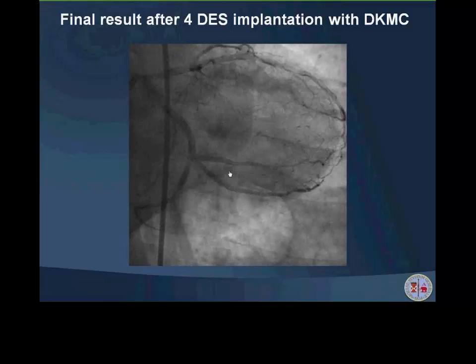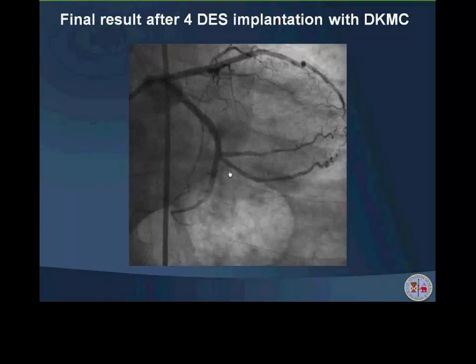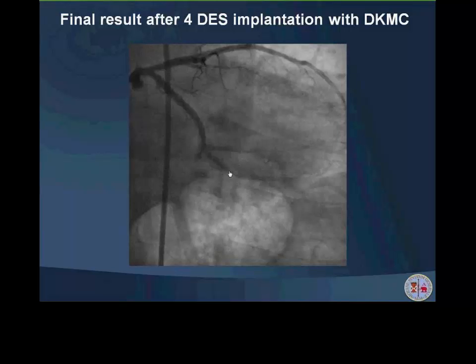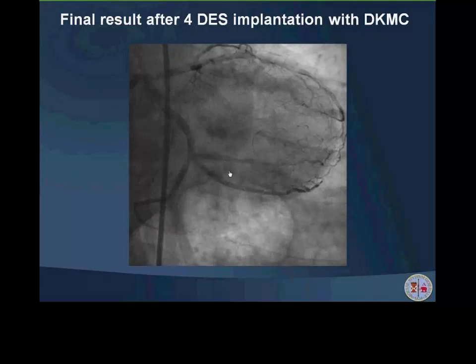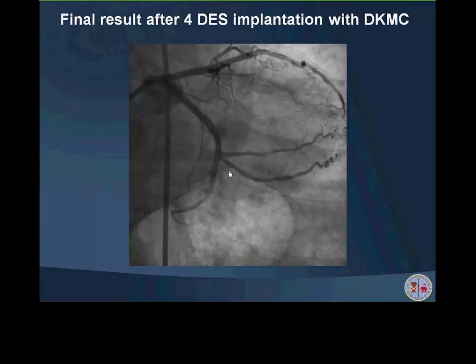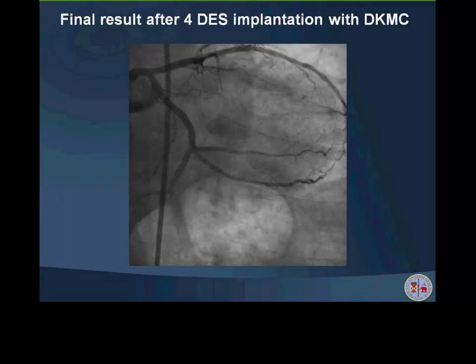Mainly, the use of dual lumen catheter in these situations keeps you basically stable in one dissection and re-entry plane, and, as you said before, allows you not to have a lot of hematoma and a lot of dissection and progression in enlargement of the dissected planes.